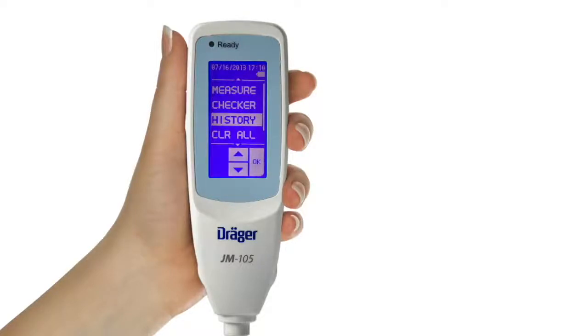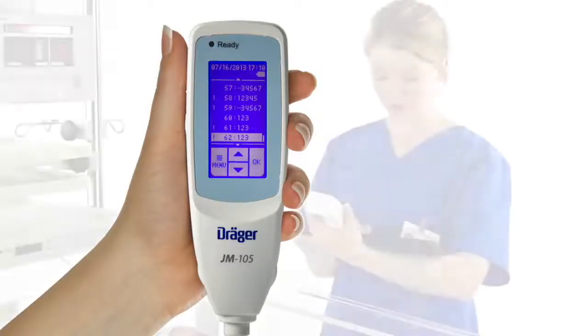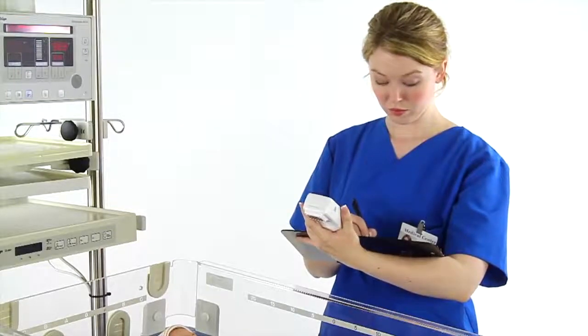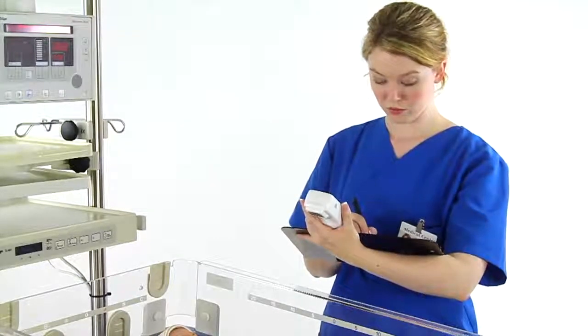To retrieve saved transcutaneous bilirubin measurements while in memory only or link on modes, go to the main menu and select History. Up to 100 measurements can be stored in the history, but the history must be cleared after 100 measurements or the JM105 will not take another measurement. If you are not using data transfer, you can clear the history as soon as you have recorded the measurements in the patient's medical record, if desired.